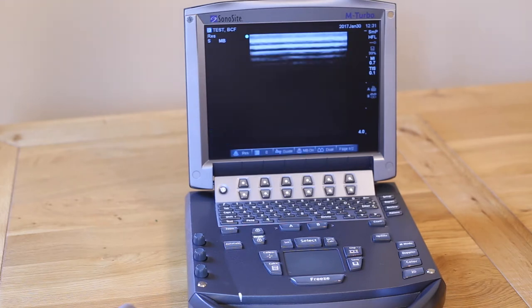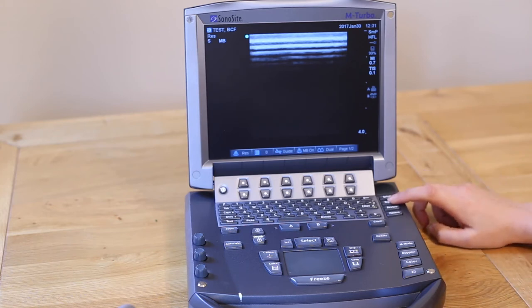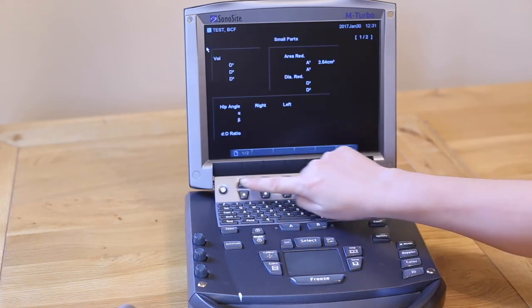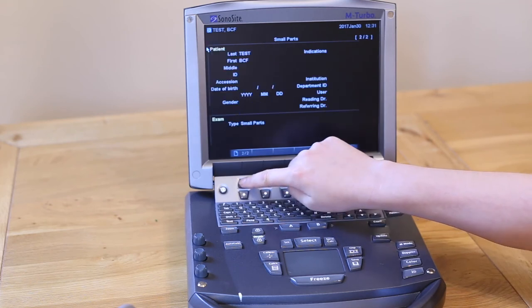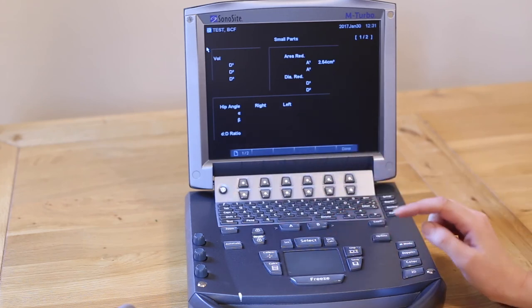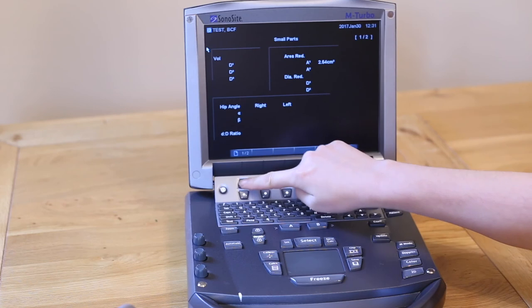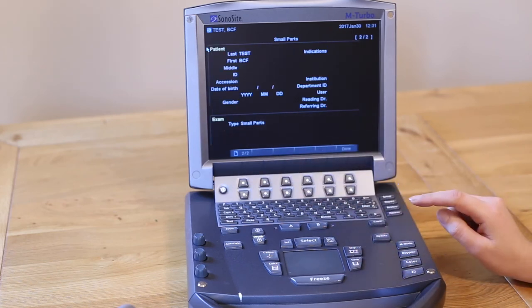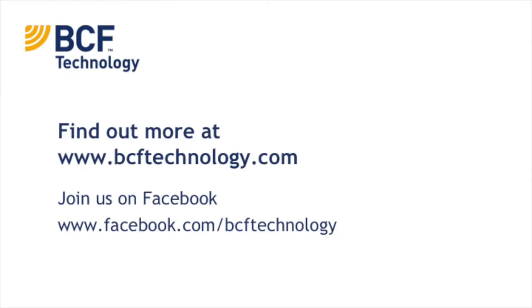If you've made any measurements during your exam, you can make a patient report to show these measurements all together. During a live exam, press Report located just above the Patient button. The left-most soft key lets you run through the pages. Press the Save button on each page of your report, then press the right-most soft key when you're finished.